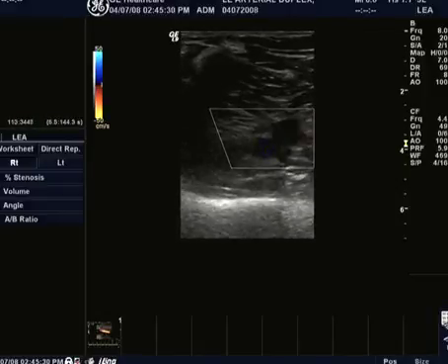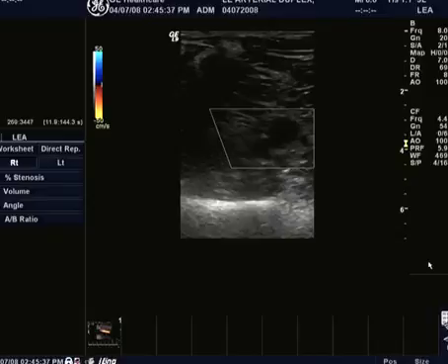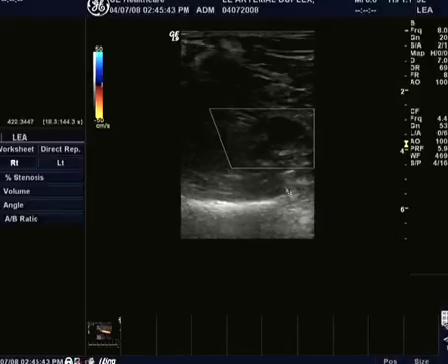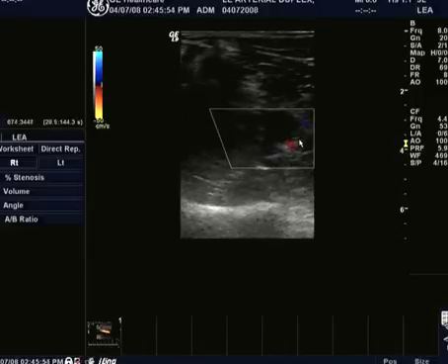Okay, now behind the knee, what goes on? The popliteal artery, just increase the gain a little bit so you can see what I'm looking at. The popliteal artery is underneath the popliteal vein at this point. Here's the popliteal artery. We can see the flash. We don't see any color filling because he's just resting quietly here. But this gives me an idea of where I need to be looking.